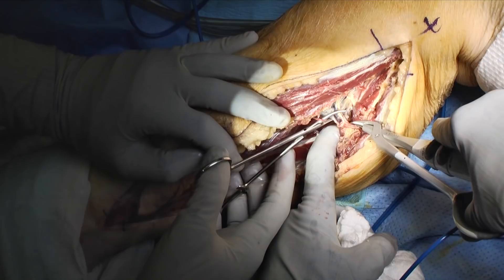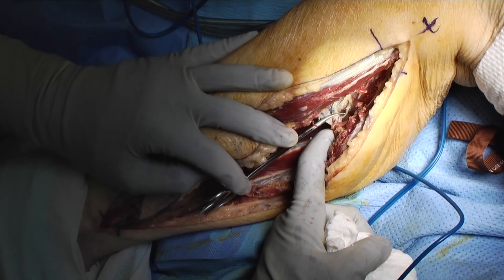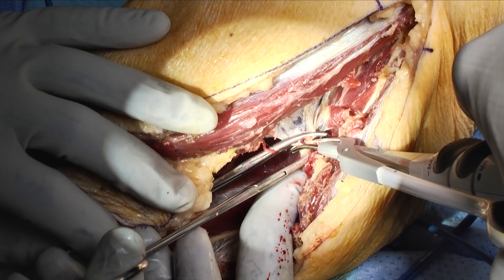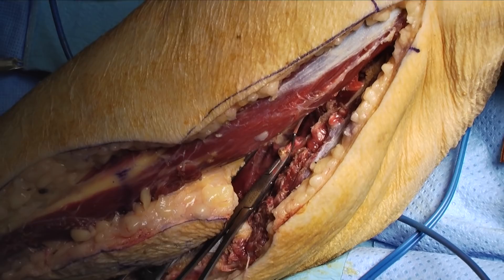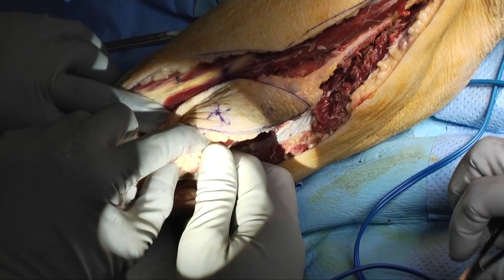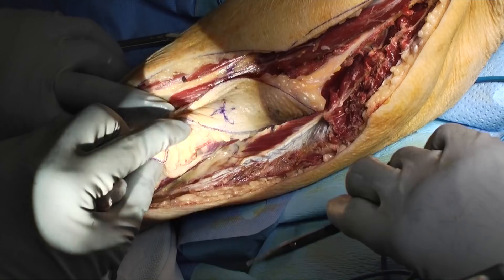Here's one of the perforators going to the gastrocnemius muscle, which is going to be divided with clamps and tied secondary to its diameter. These vessels should be divided several millimeters away from the fibula so as not to injure their takeoff from the peroneal artery and vein. The fascia overlying the flexor hallucis longus muscle is cut at this point, which allows easier elevation and more mobility on the fibula once the bone cuts are made. This fascia can be divided the entire length of the flexor hallucis longus muscle.